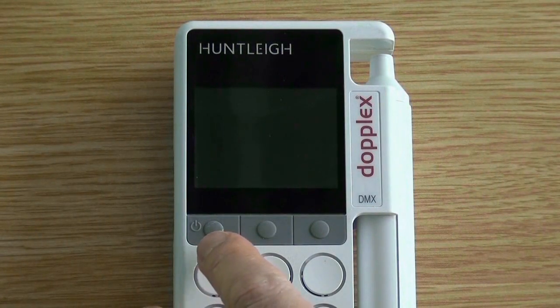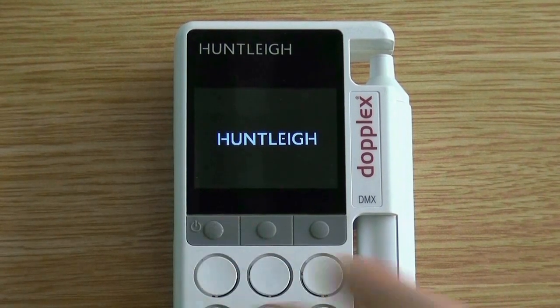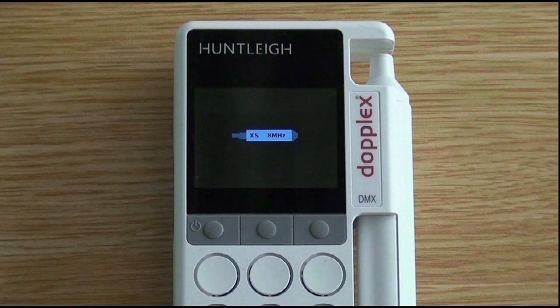Turn on the product by pressing the left hand button for one second. If a probe is connected you will quickly see the probe recognition screen. If a probe symbol with a question mark appears then an old probe has been connected. Note that HS probes will not work with the DMX Dopplers.